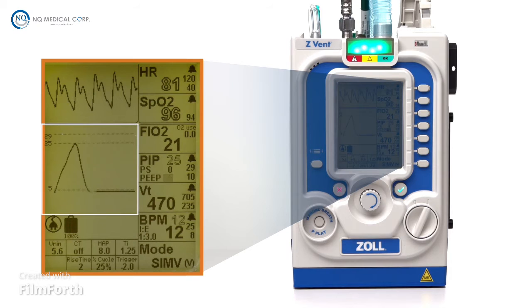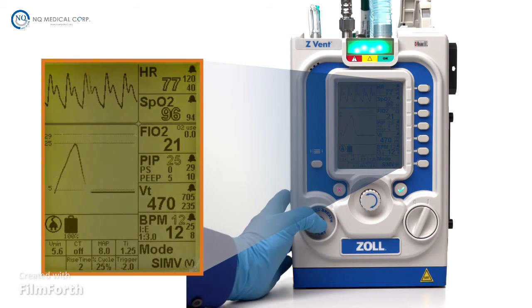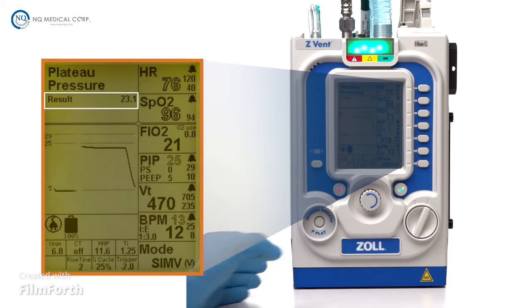The pressure time waveform is displayed directly to the left of the PIP parameter window. This waveform displays, in real time, the patient's PEEP level, the actual PIP, and the high pressure limit. The waveform plots airway pressure against time and is automatically scaled based on the breathing rate, PIP target, and high pressure limit alarm settings. When operating in volume-targeted breathing mode, pressing the manual breath/plateau pressure button changes the displayed waveform to a plateau pressure waveform measurement and displays a numerical result.